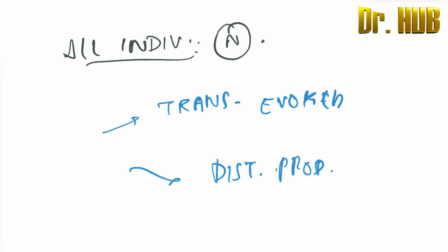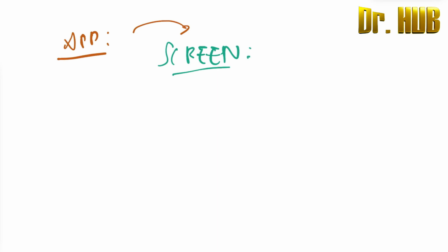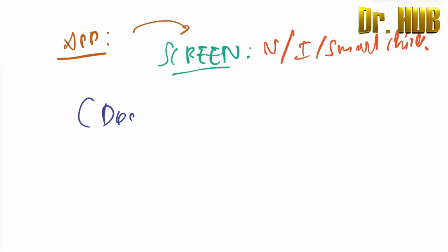Now, what are the applications of the OAEs? Going by the application, it includes the screening test. The screening test is for neonates, infants, and small children, and it screens for deafness due to inner ear causes.